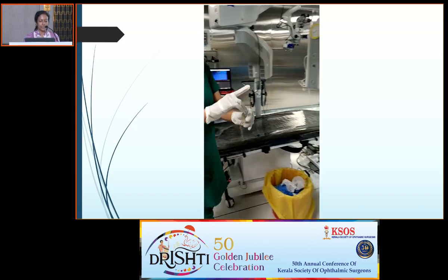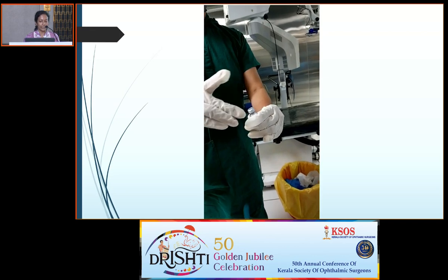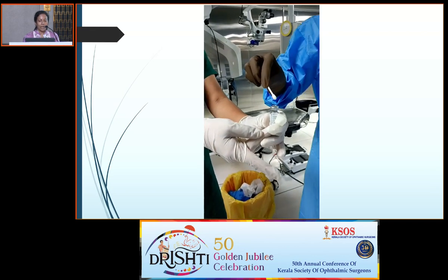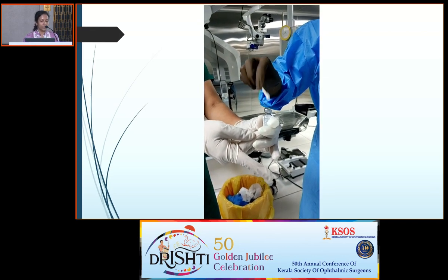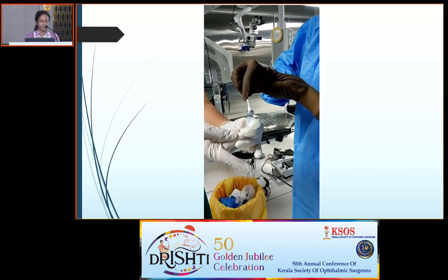Now the sister brings in the injection. Very carefully she removes the top plastic cover without touching the inside part. I now sterilize the top of the vial with a little bit of spirit, and then bring in a fresh bud and remove the spirit.